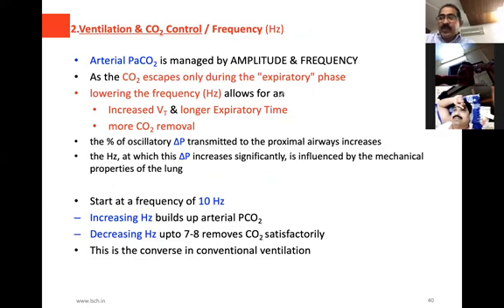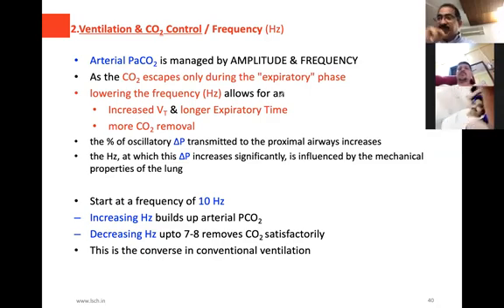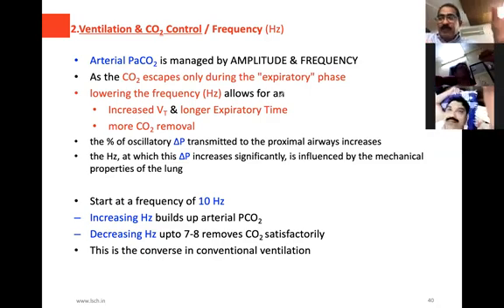You have to be very, very careful, because if you make rapid changes in the frequency, that is not good for the child at all. So you should make very, very fine adjustments with the frequency, and you are okay to make big rapid strides in your amplitude. So be very, very careful. First, fiddle with your amplitude.